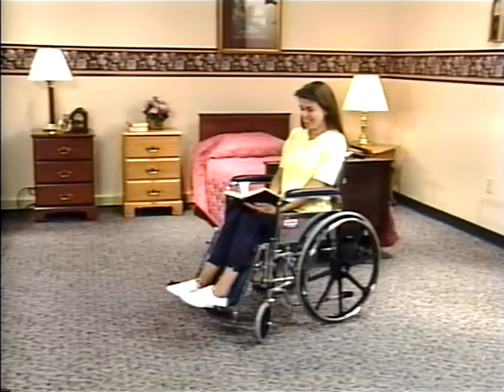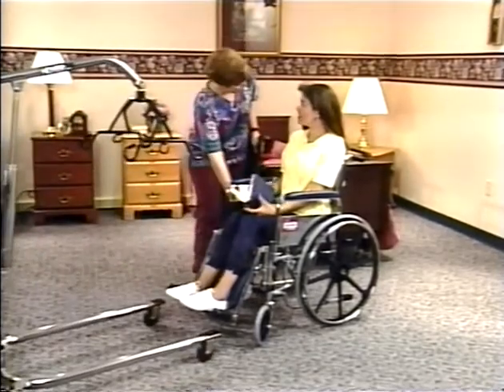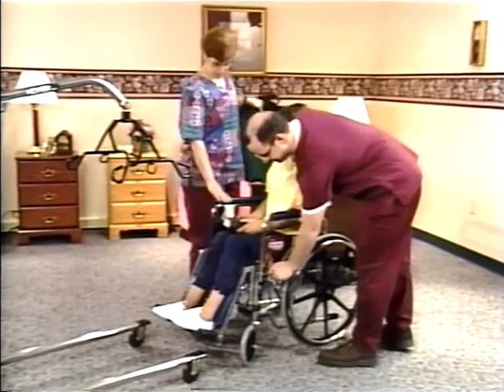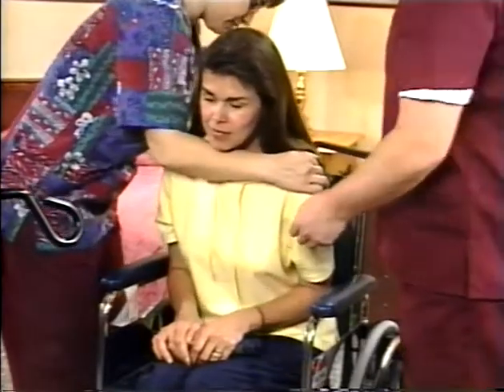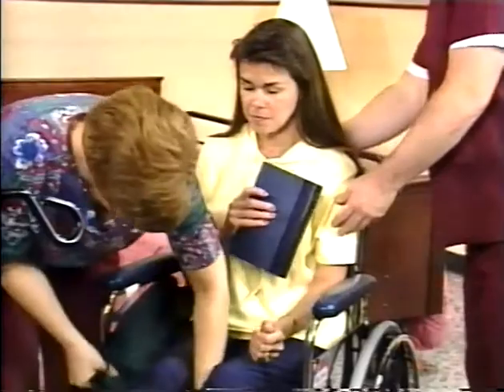Position yourself in front of the chair. Gently lean her forward and put her arms on her knees for stability. Place the folded sling behind her and tug it down so the bottom edge touches the seat of the chair and the top edge is aligned just below her shoulder blades. The folded leg flaps should be on the outside.